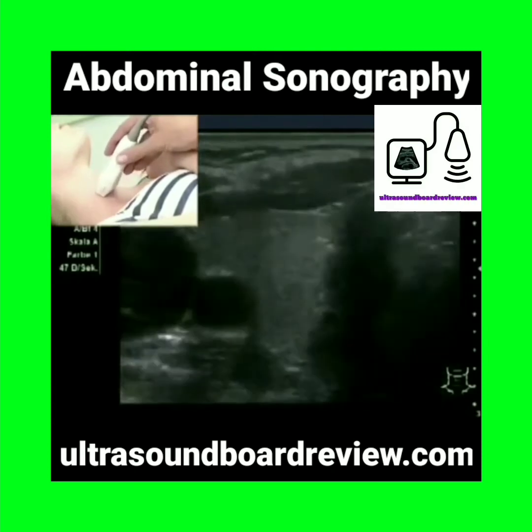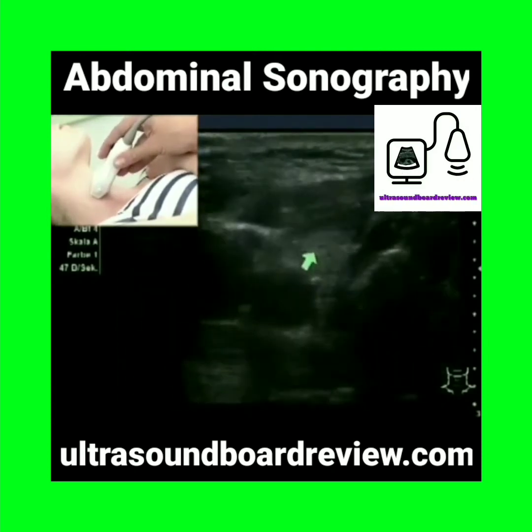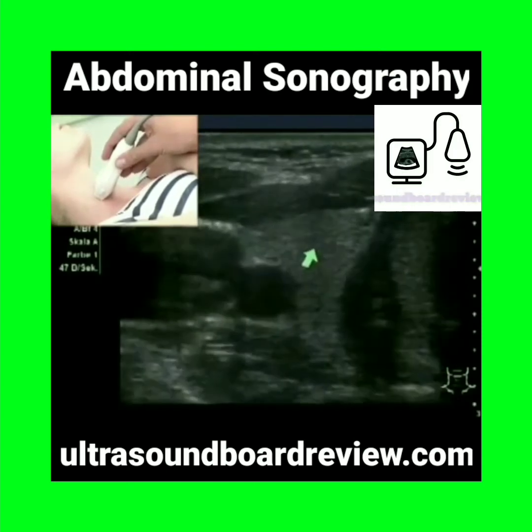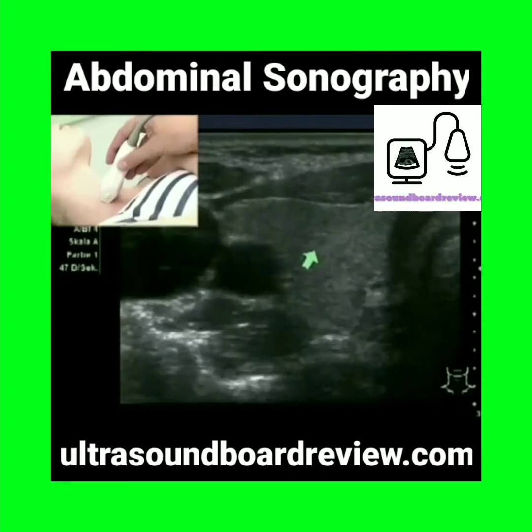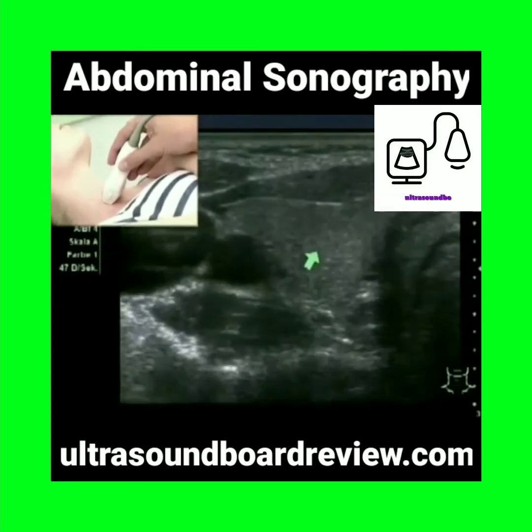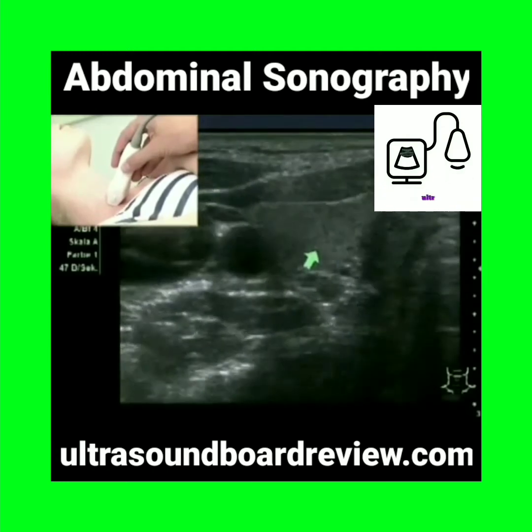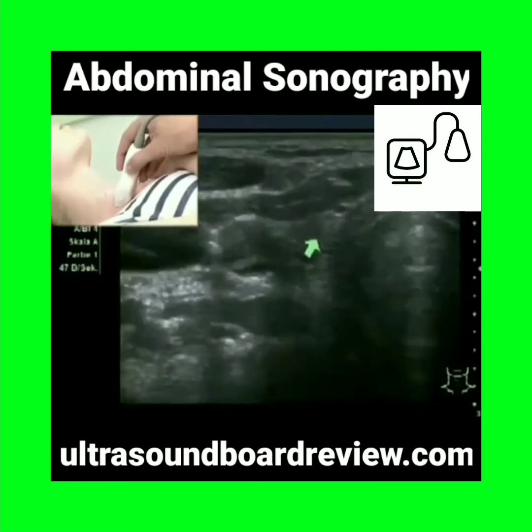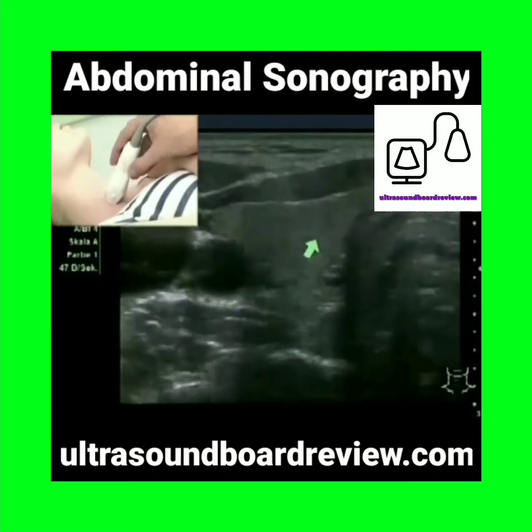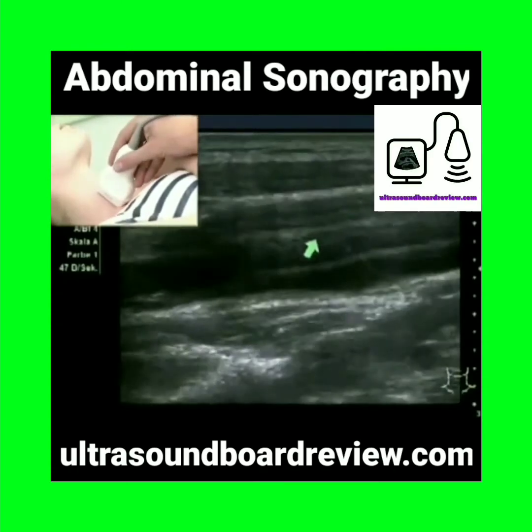And start our scan at the upper pole of the hyperechoic thyroid gland tissue and follow the gland to rule out focal lesions or enlargements. Then we rotate the transducer clockwise by 90 degrees.